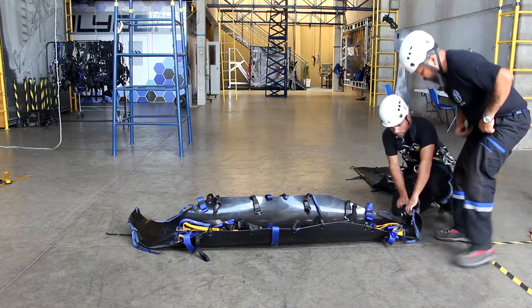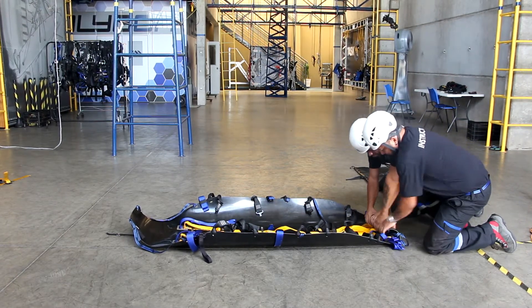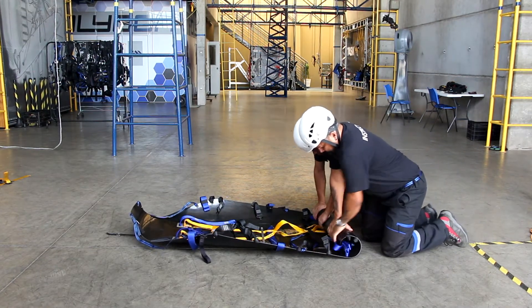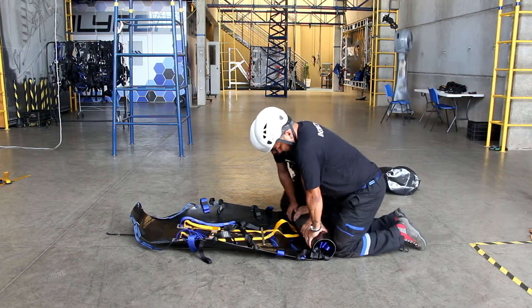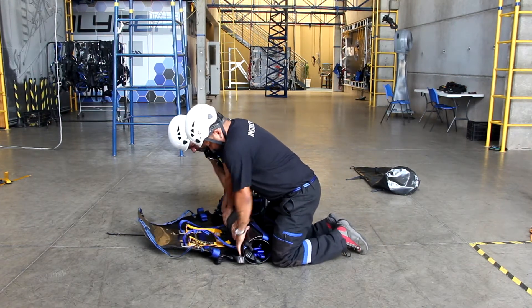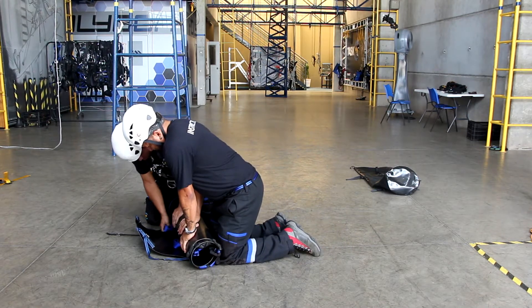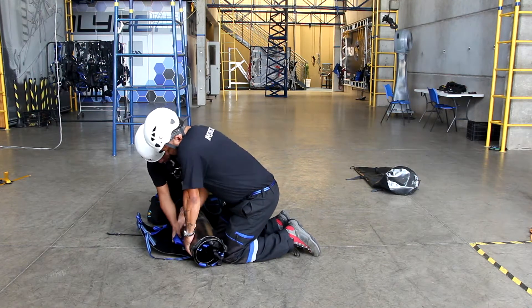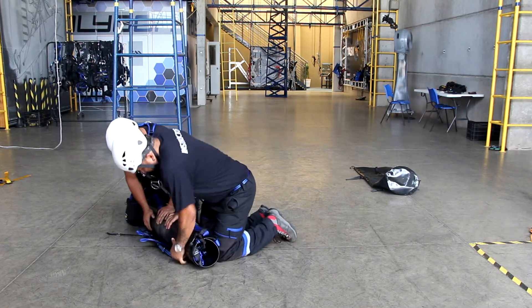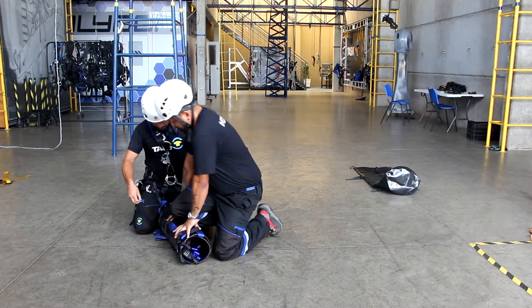Start to roll up the stretcher from its lower part. The two attendants must be on their knees to begin rolling up. We recommend to put your weight over the stretcher using your arms during rolling up. Finally, fasten the stretcher with the small black strap.